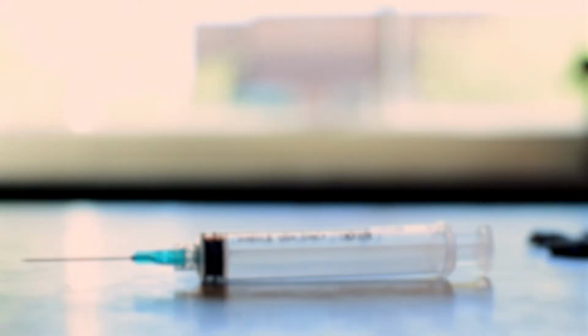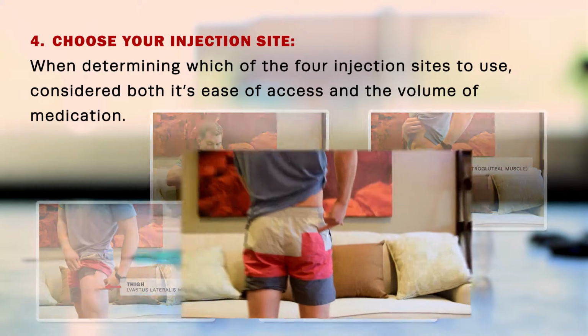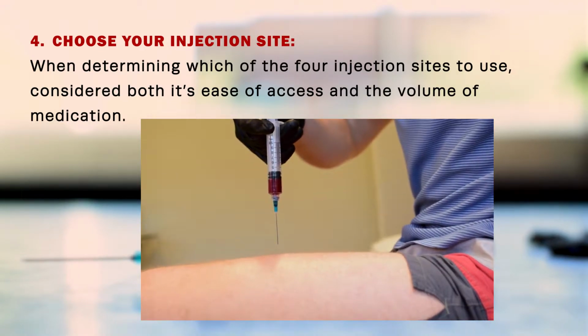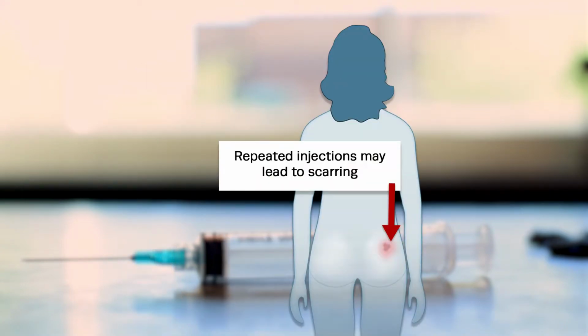Once you've gathered all your materials, it's time to choose an injection site. When trying to determine the most suitable injection site, you need to consider both the ease of access and the volume of medication you intend to inject. Some sites cannot handle large volumes, while others may be more prone to skin trauma.